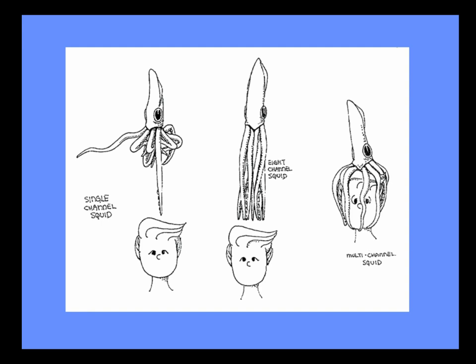MEG has a bit of a history. EEG was started by Lord Adrian back in the 20s with tubes and things to measure the electrical activity recorded from the scalp. Well, MEG, magnetoencephalography, is going to record the magnetic field that is generated by that same electrical activity in neurons. The first sensors to be able to do this, to have enough sensitivity, was a single channel SQUID. SQUID stands for superconducting quantum interference device.